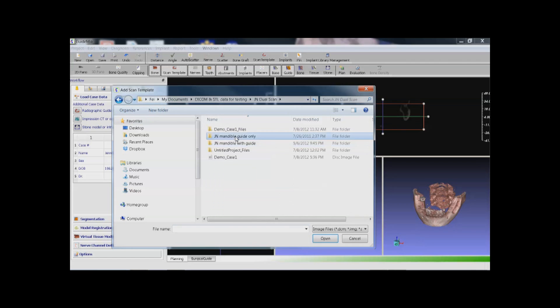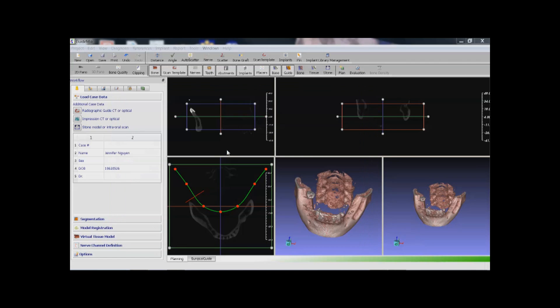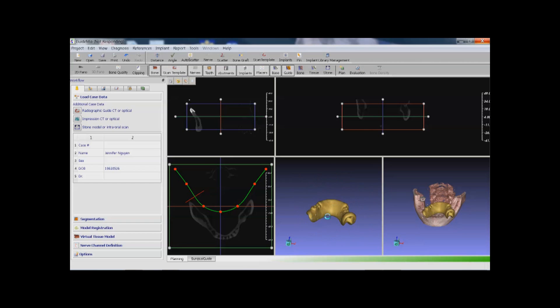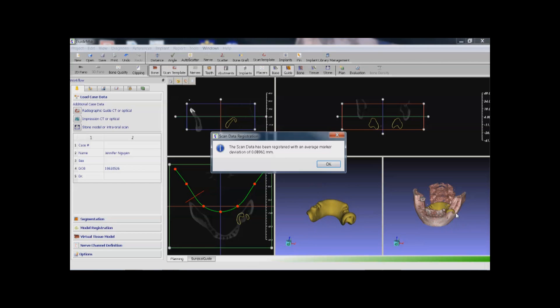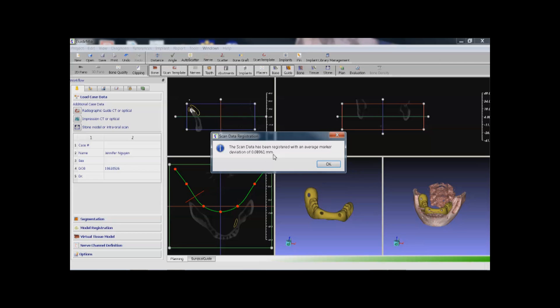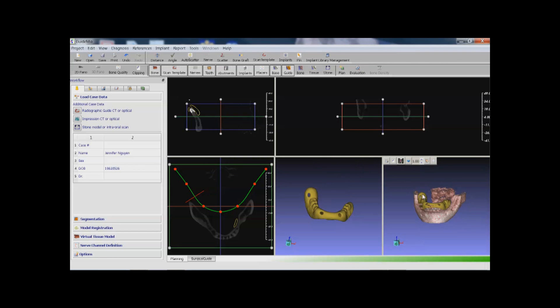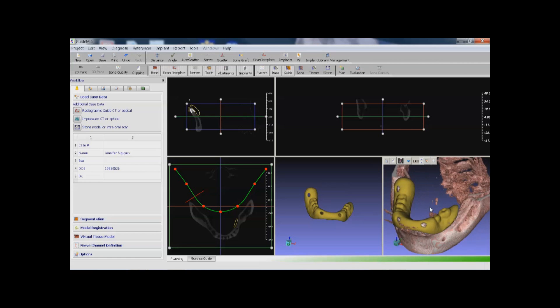We select the DICOM file. Now three things are happening: we're loading the DICOM file, we're creating the radiographic guide model, and this is all registering with the patient scan — and all of this is, of course, automatic. The system also tells you how much deviation the scans have. The automatic registration can very well take care of the X-ray scatters in this case.